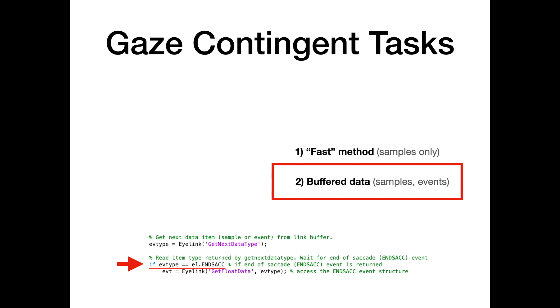We check if EVType contains the item we are looking for. In this example, we're waiting for the end of a saccade, so we're going to check if EVType is the end of a saccade event. If so, we access EVT, which is a MATLAB structure returned by EyeLink_GetFloatData, and which contains information about the end of the saccade. We can then use this information for our gaze contingent task. For instance, we could present a target at the location of the end of the saccade, as we'll see in the next demo.